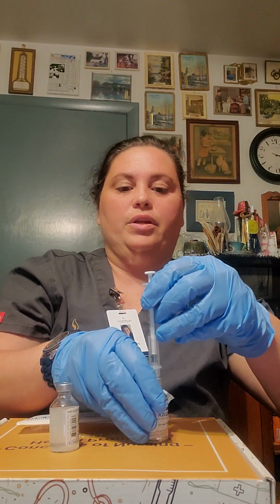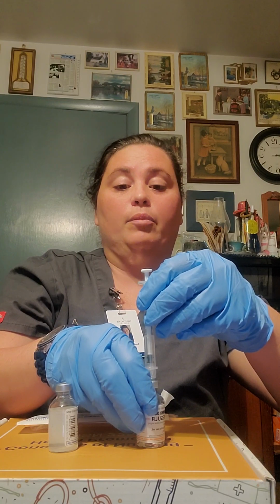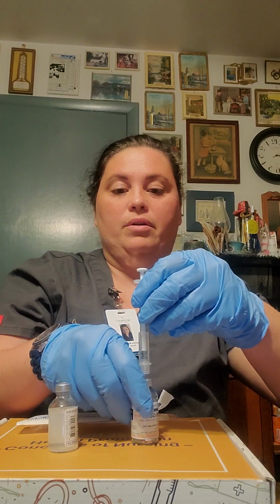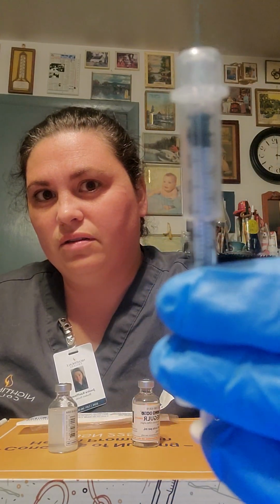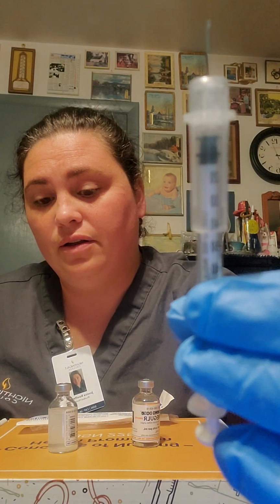Going to invert it. I would flick the air bubbles if I had any air bubbles, but I do not. Alright, so I am going to withdraw this slowly. Okay, as you can see, I have 4 units in there.